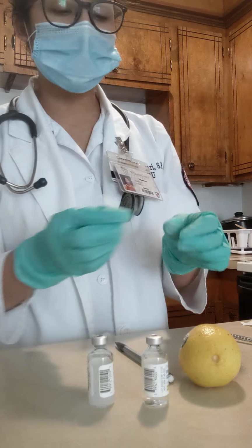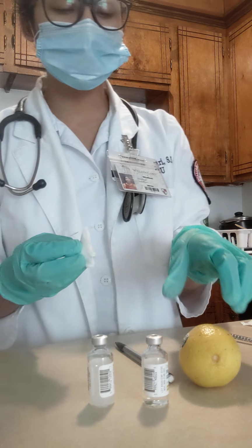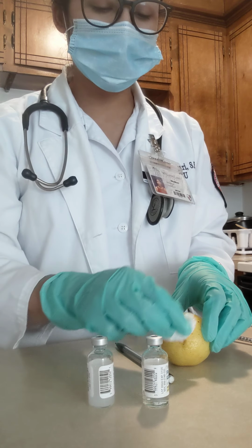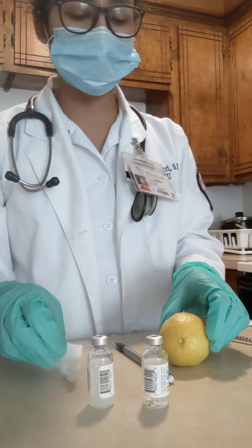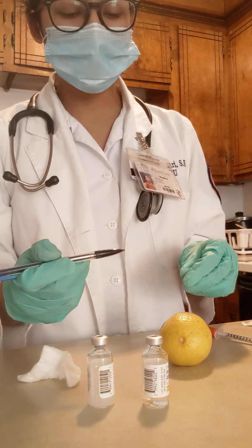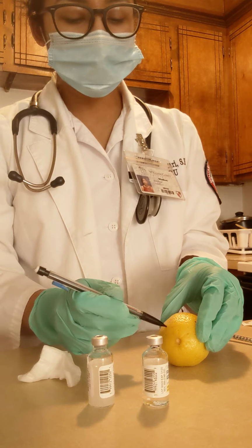Since my patient has washed his hands and they are completely dry, I'm going to take an alcohol swab and clean the site. The site is going to be the lateral aspect of the distal end of his index finger. I'm going to clean it in a circular motion and let it dry. When it's completely dry, I will prick the patient. 1, 2, 3.